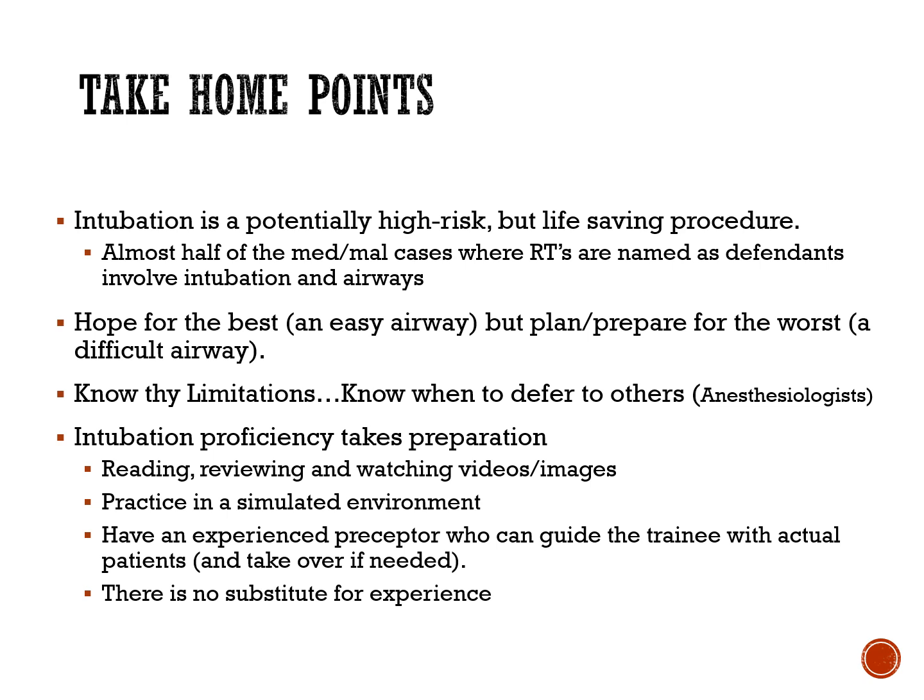And part of it is knowing what to see, knowing your landmarks, knowing your anatomy, watching as many videos as you can, preferably in the context of a structured training environment. Have an experienced preceptor, whether it's an anesthesiologist, a pulmonary critical care attending physician, or a fellow respiratory therapist, be your mentor and preceptor in guiding the trainee with actual patients, and if need be, take over if needed.